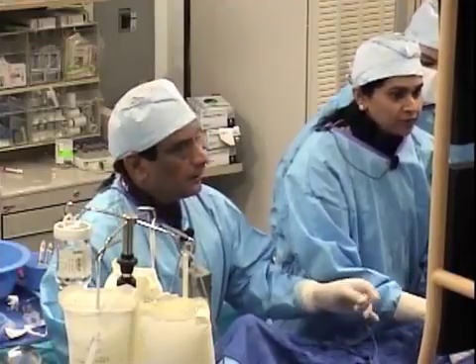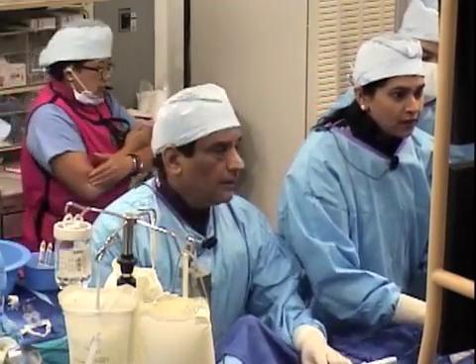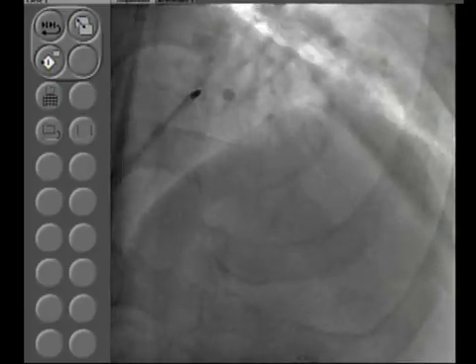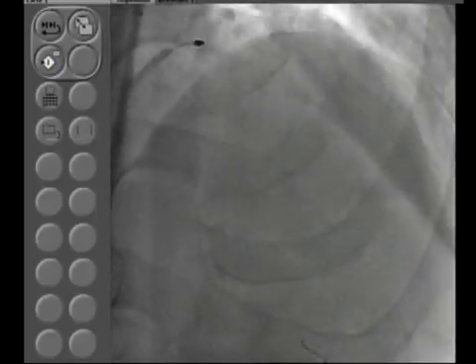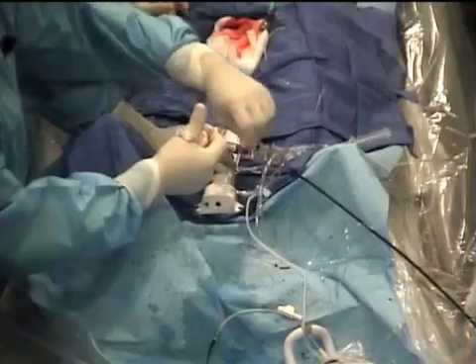Despite your experience of decades of using the rotablator, you still always use the same 3 steps? Same 3 steps. Every case? Yeah. I tell the fellows that even in the middle of the night in their sleep, these 3 steps should not be forgotten. And this is again all part of the teaching. For all the fellows in my intervention program, we have 8 of them, I told them to write down the steps. Once they write, they know they are not going to forget. Again 3 steps: backward, forward, and then movement with the dyna. Good.